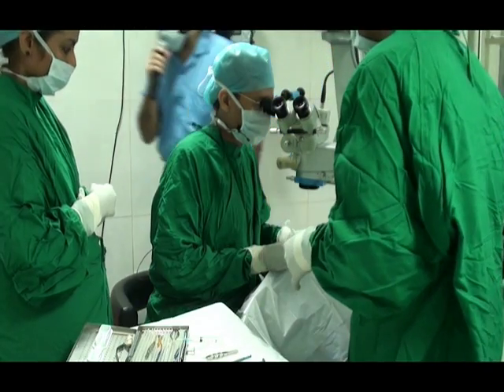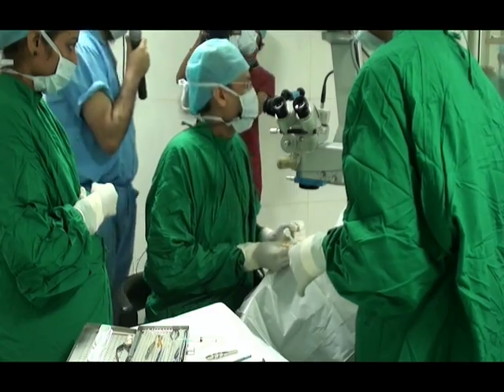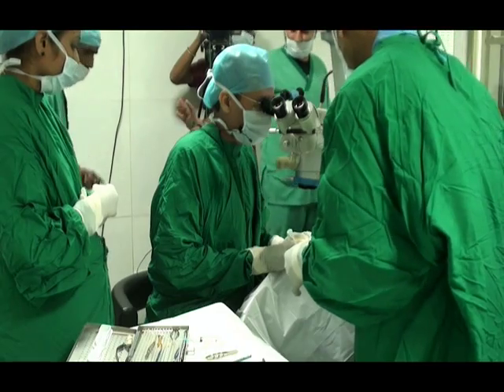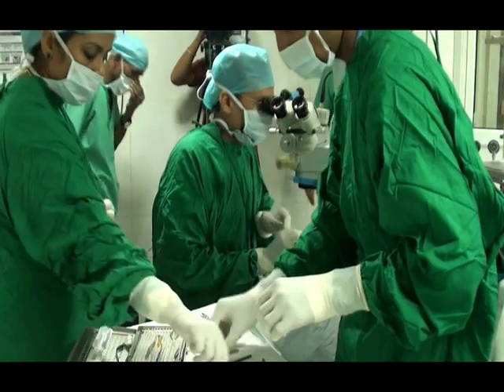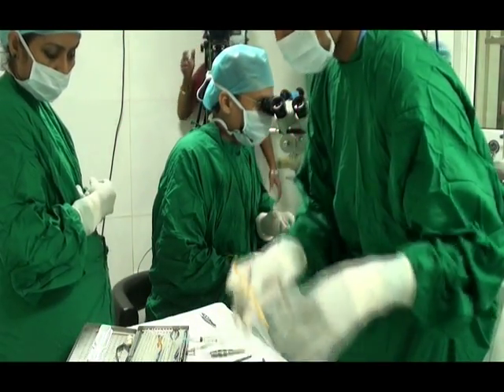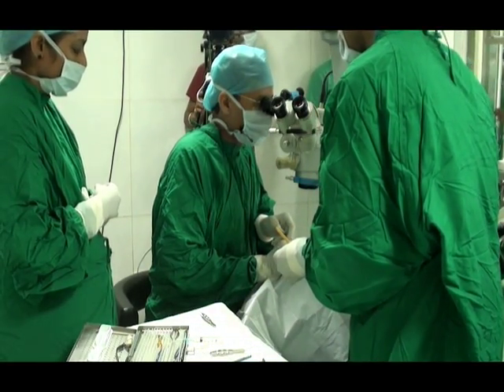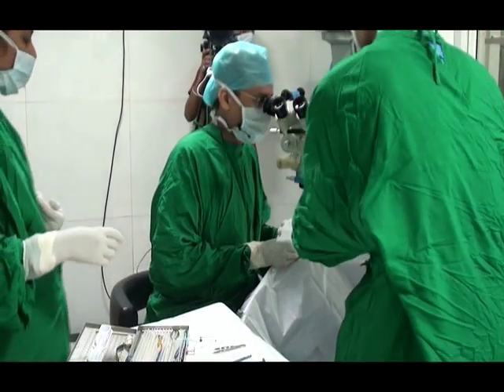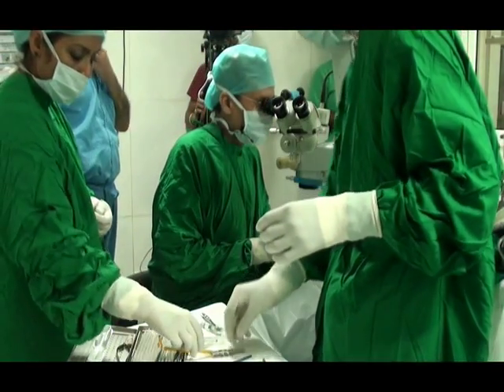Good morning Dr. Lal, this is Dr. Suresh Pandey. I am going to do phacoemulsification in a 54-year-old male. I first created a side port incision and then I am going to fill up the anterior chamber with the viscoelastic Healon. I am injecting Healon inside the anterior chamber. After injecting the viscoelastic, I am going to create the main incision at the steep axis, which is 180 degrees.